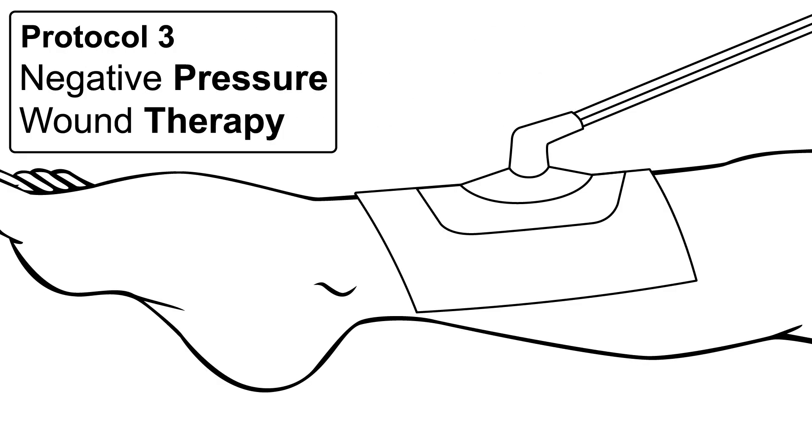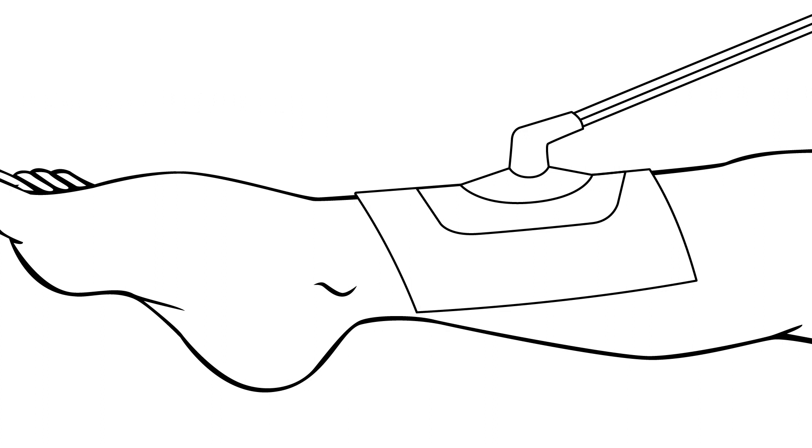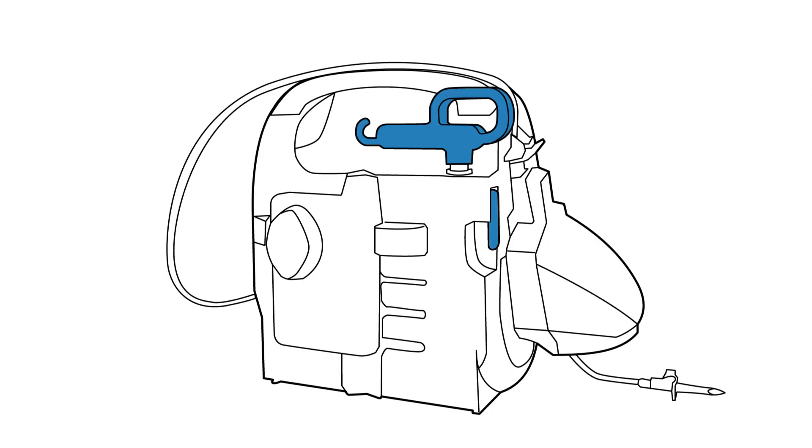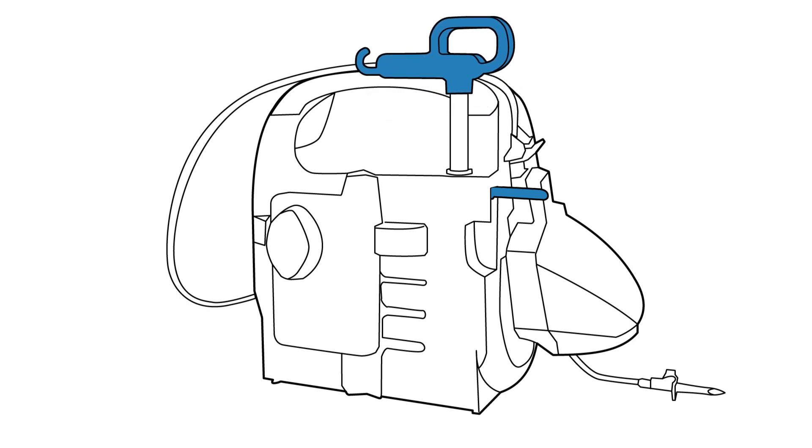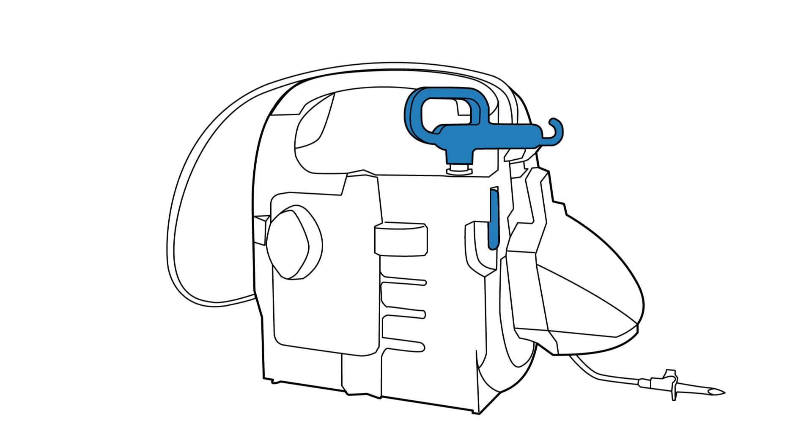Vashe can be used with negative pressure wound therapy as the instillation fluid. Use the provided hang tab, fold it out and hang on device arm by raising and rotating the arm 180 degrees. Lock into place.